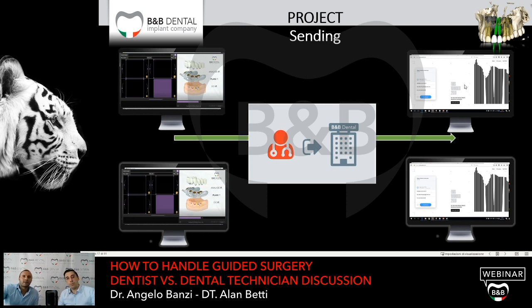Once I've placed the implant and I've checked for the abutment parallelism, another important thing is: do we always need to work with perfect parallelism of the abutment? No. If you use a multi-unit abutment or flat abutment, you don't need to parallelize all the implants perfectly.